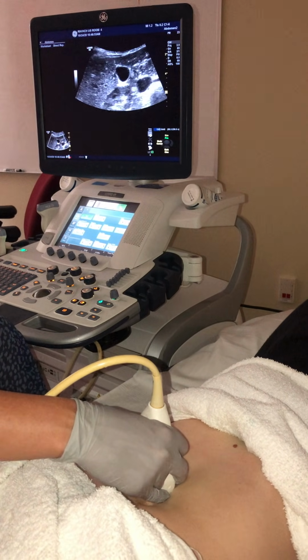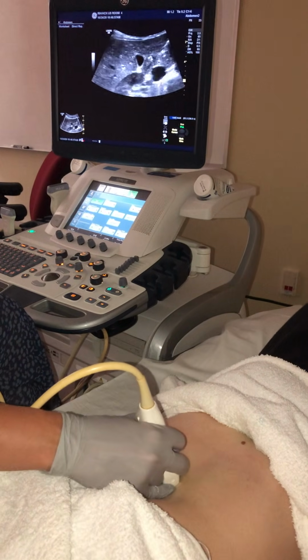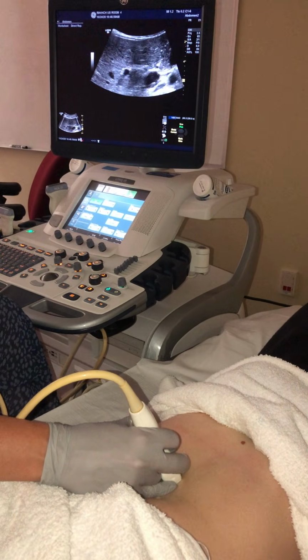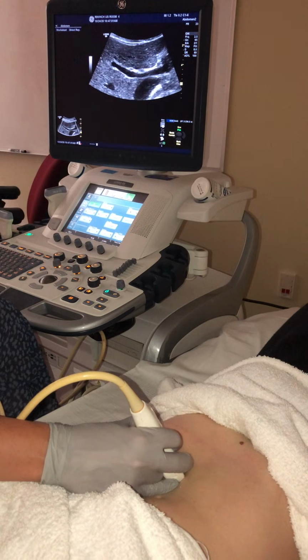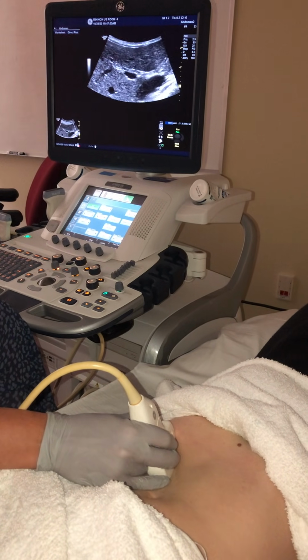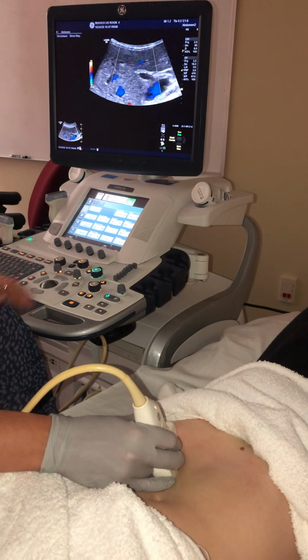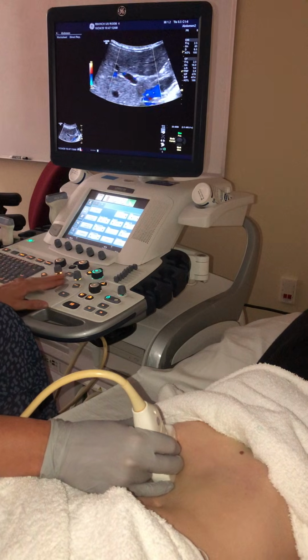So here we have transverse. This is how I like to find common bile duct. We have transverse gallbladder. I sweep up a little bit under her rib cage, I'm going to find her porta hepatis, her portal vein here, and I'm going to turn my transducer towards her right shoulder. I put my color on to confirm.